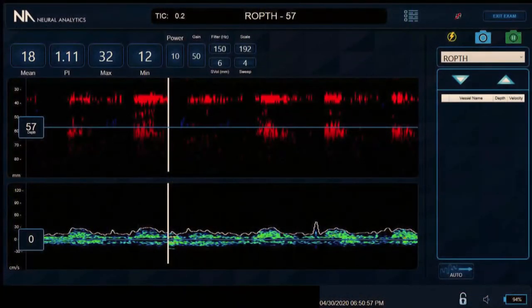As a quick review, I just want to show you that your ophthalmic is antegrade. But look, half the people watching this have never even seen this before. They need to come back for the TCD interpretation class. We're not going to have a carotid TCD interpretation class in one hour. What I want you to pay attention to is this waveform. The TCD will show you the same waveform on the bottom. It's nice and blunt.